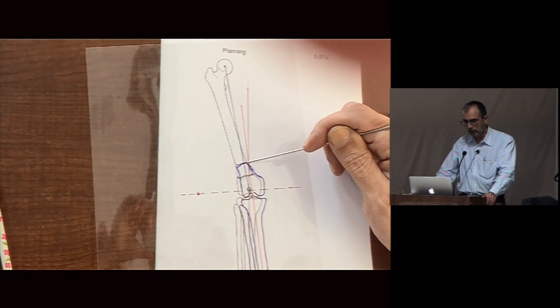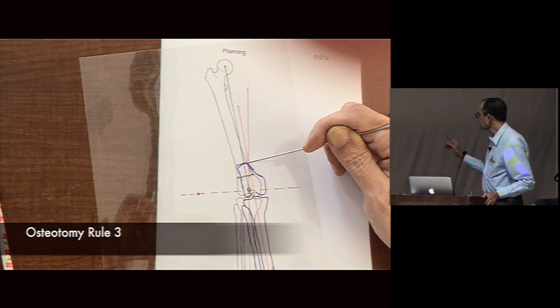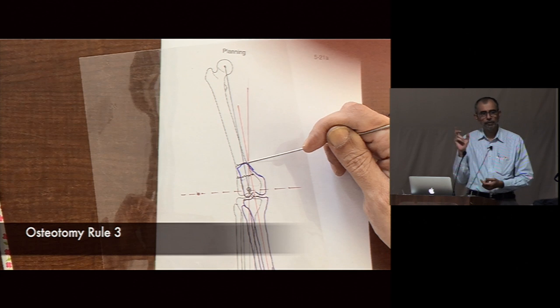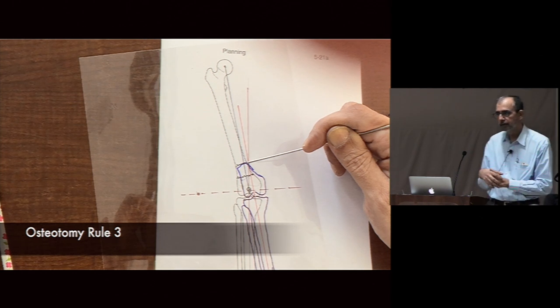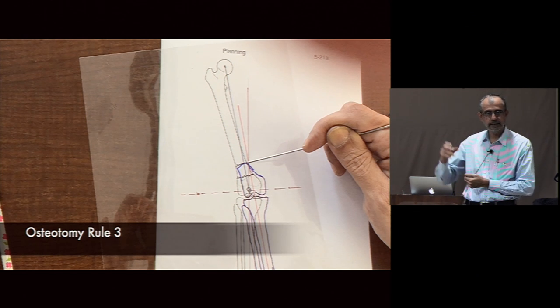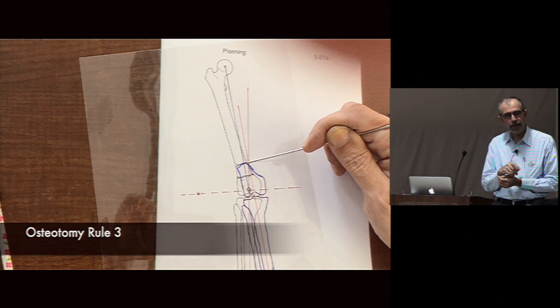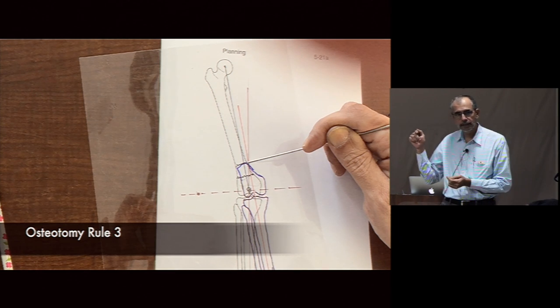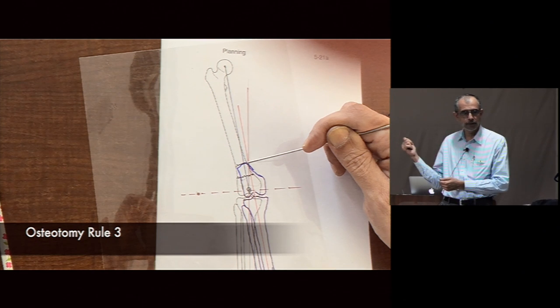And if we do the wrong thing, now look at this, all of you will have seen this shape in distal end femur fractures that you have fixed, right. This is the golf club deformity. And why does that happen? Because you have not put your DCS or your blade plate parallel to the joint. If you put it parallel to the joint, you do not get this deformity.